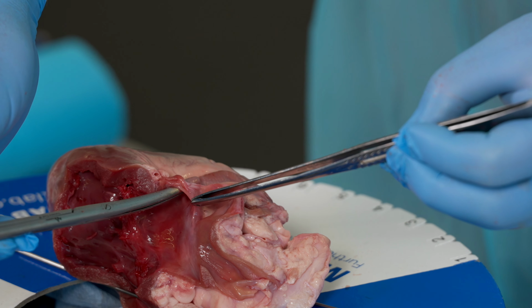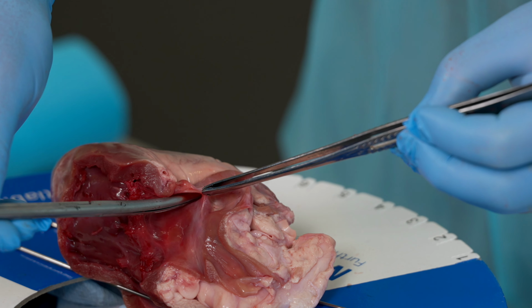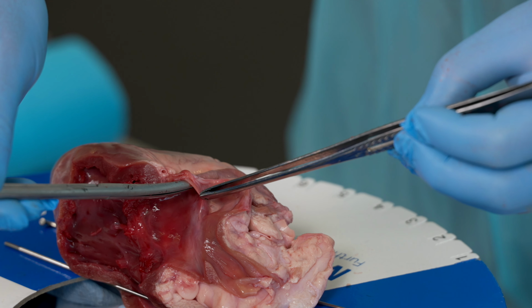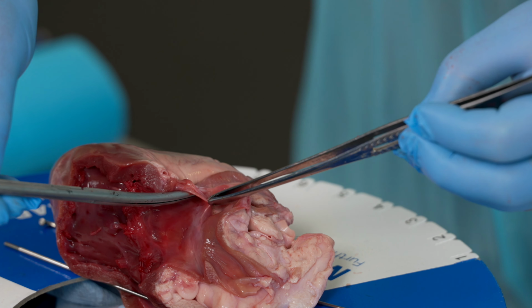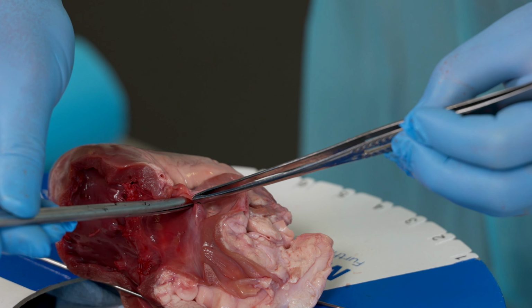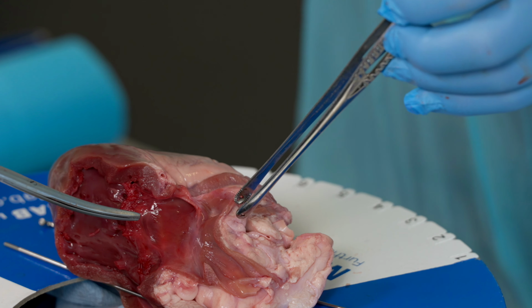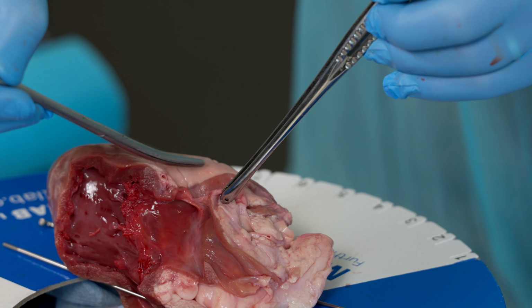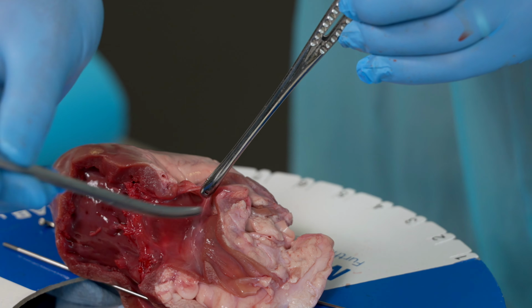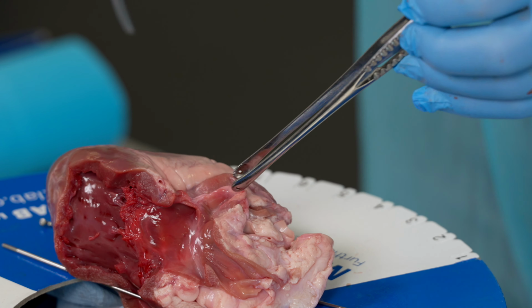And you'll see the pressure augmenting as the perfusion begins. But if the balloon is only here, sometimes you get valves in the coronary sinus, and it can prevent the balloon going in where you want it to go. So if it gets stuck just here and can't go any further, then when the balloon is inflated, it makes it eject into the right atrium. And so in cases like that, you may have to put a finger down between the IVC and the base of the heart and lock the balloon in place with your finger, and then you will achieve satisfactory retrograde perfusion.